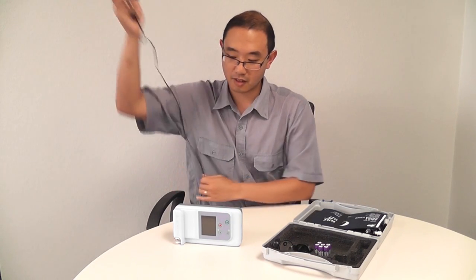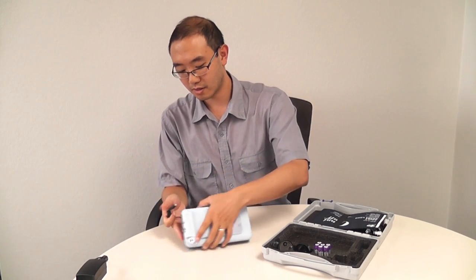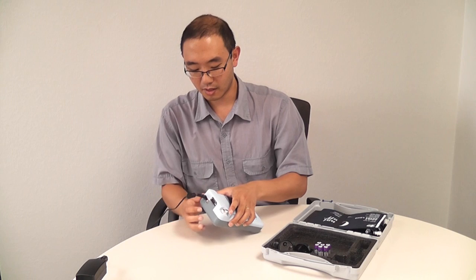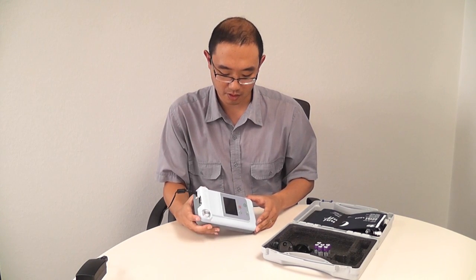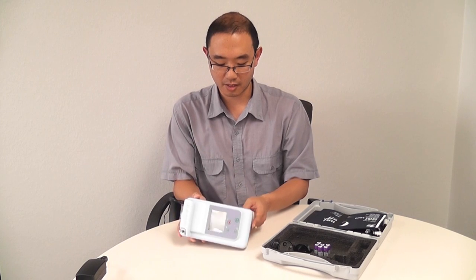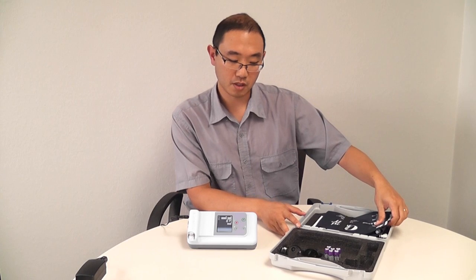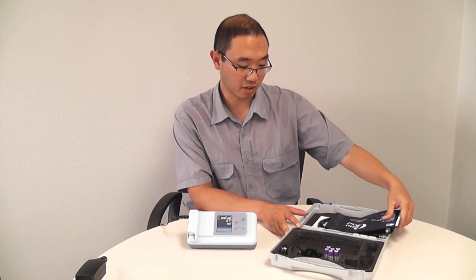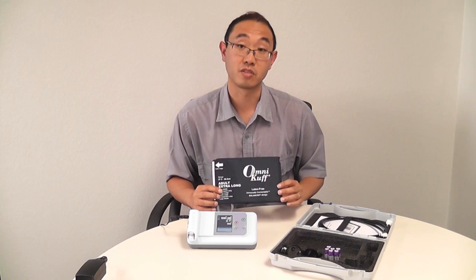We can plug that in into the side of the device, and the switch is also on the side, so we can turn that on. The device has a stand on the back, so we can stand that up. While it boots up, it does a power-on self-test to make sure everything's okay, and we'll get out the cuff. It comes with a range of cuffs.